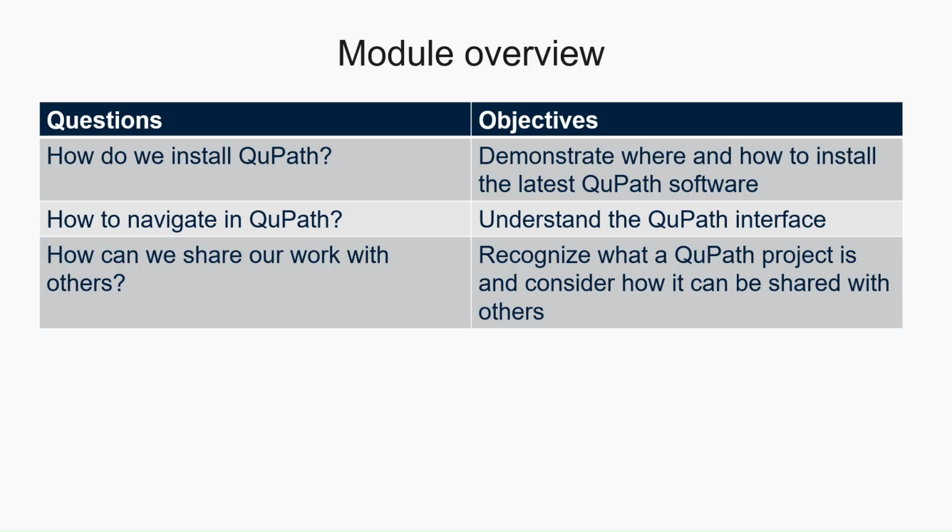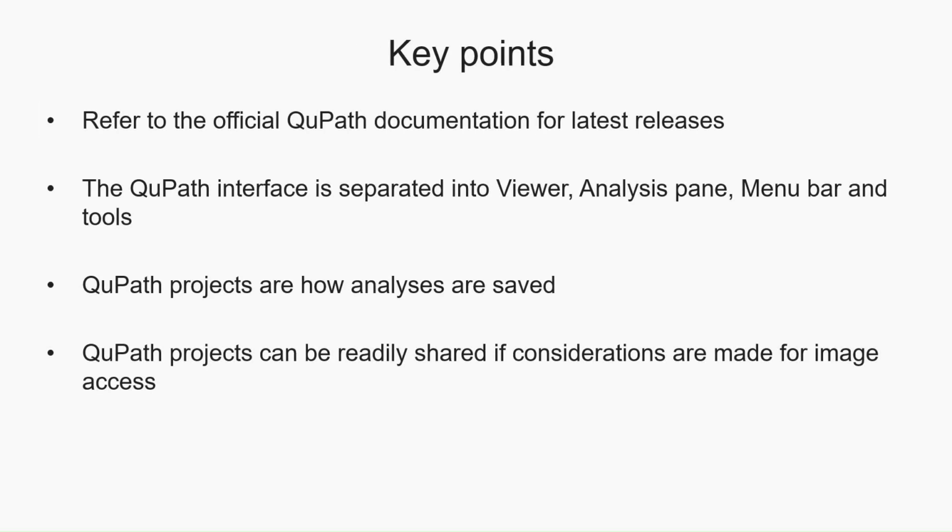That brings us to the end of this module, where we have addressed the following questions on how to install QuPath, how to navigate in QuPath, and how we can then share our work with others. The key points for this module is that we can refer to the official QuPath documentation for latest releases, but also for common problems on installation.